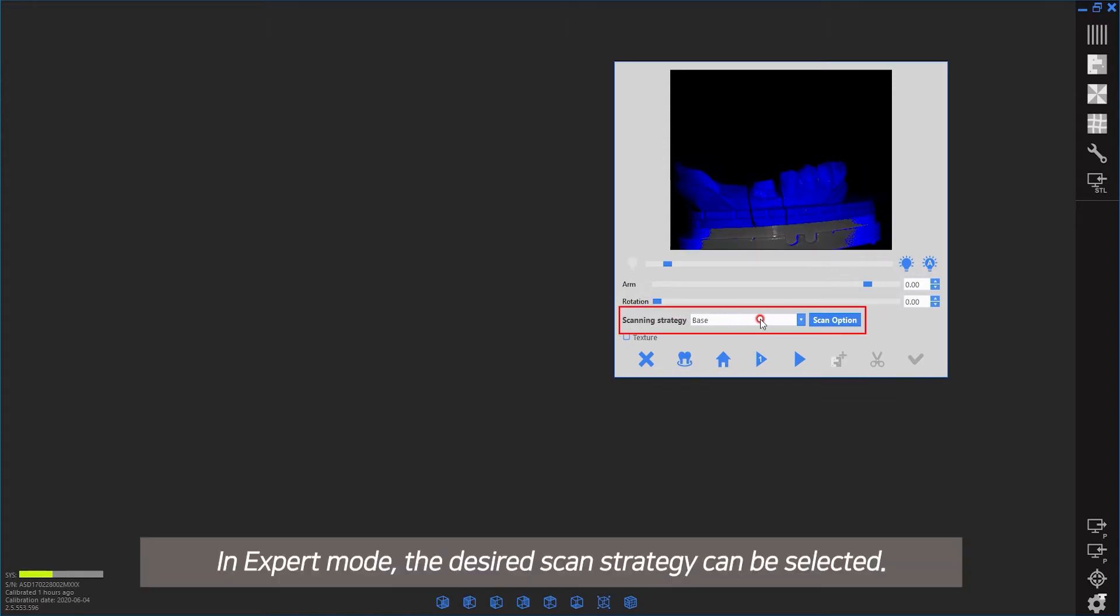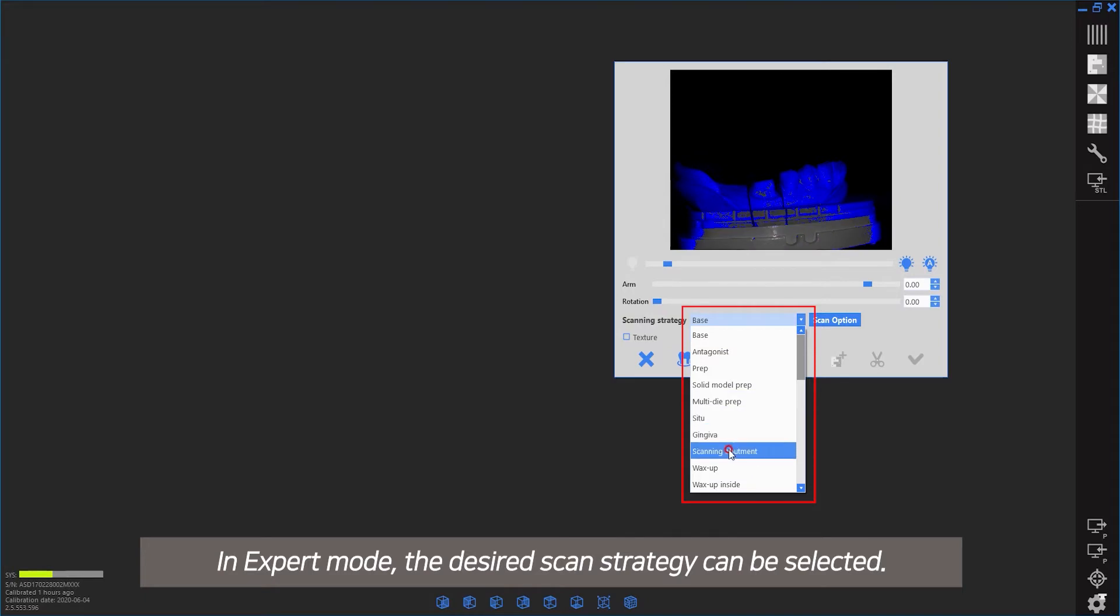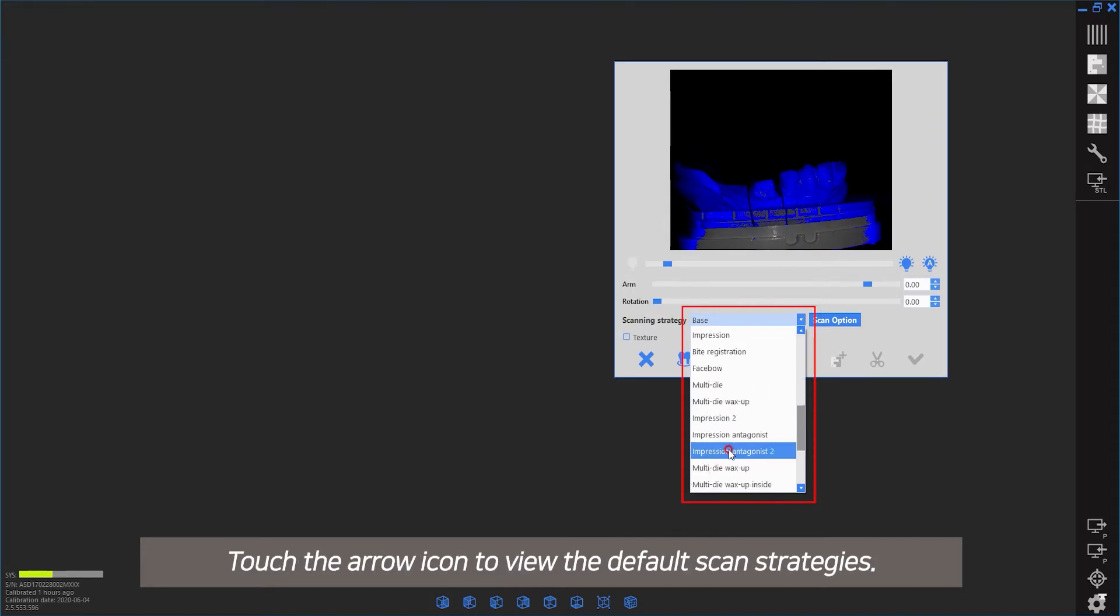In expert mode, the desired scan strategy can be selected. Touch the arrow icon to view the default scan strategies.